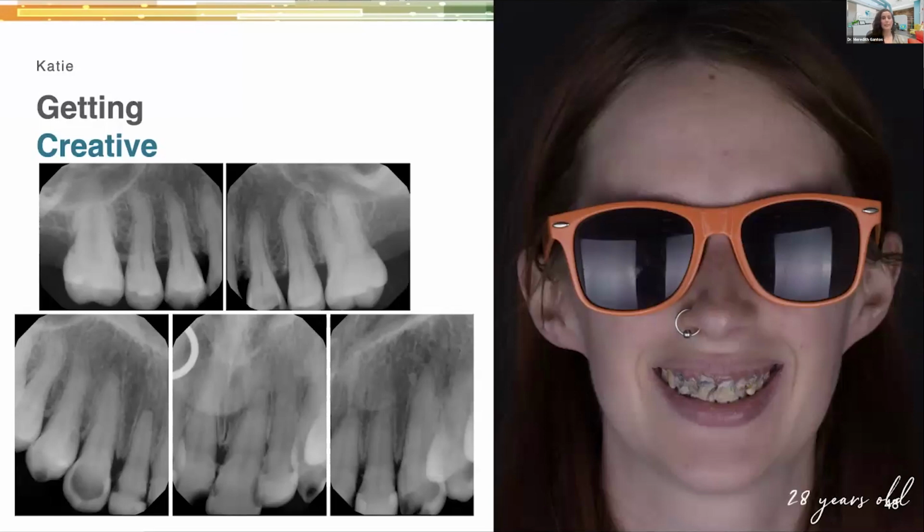They're going to stain and glaze it. They're going to come back. They're going to try it in. They're going to get patient consent that they like the way that it looks. They're going to take that off. They're going to etch and prime it, clean everything up.